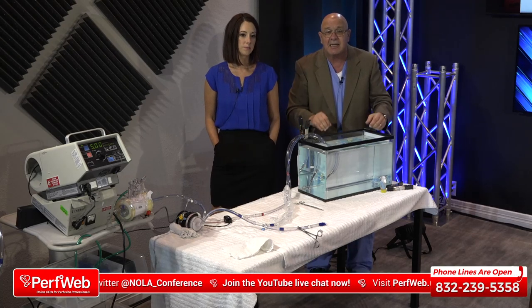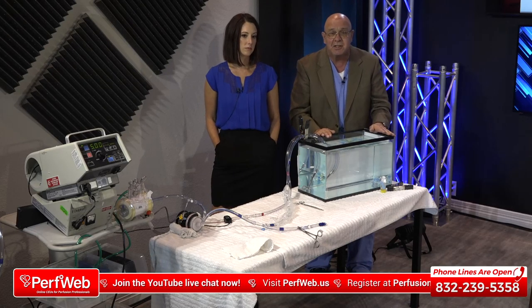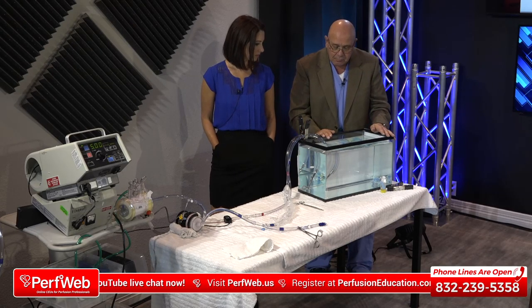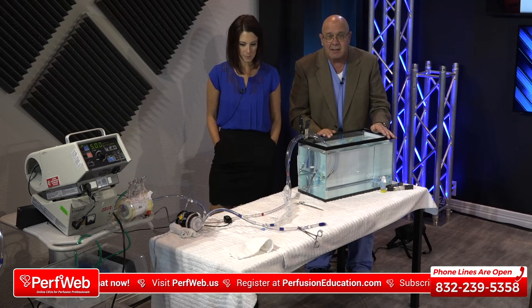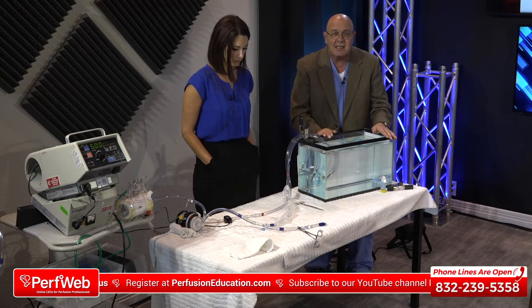I'll do anything I can to help because it's all about taking care of the patient. That's what we're all here for. So this patient collapsed on the floor, suspected PE. The PERT team was called, and they put the patient immediately on VA ECMO.